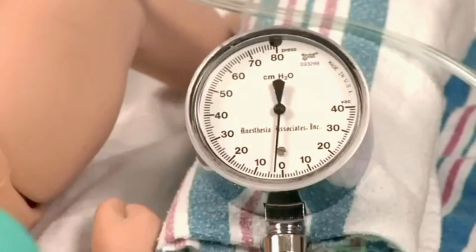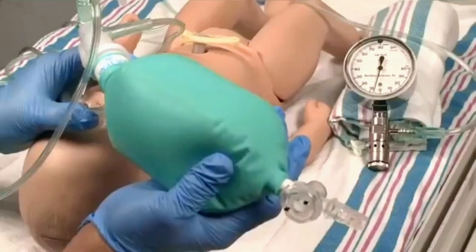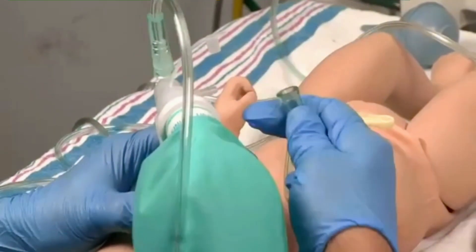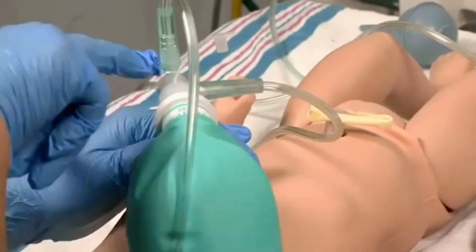The end expiratory pressure remaining in the system at the end of a breath is called PEEP when the newborn is being ventilated, and CPAP when the newborn is breathing spontaneously. The pressure gauge may be attached externally, or the gauge may be built into the bag, positioned between the patient outlet and the neck of the bag.